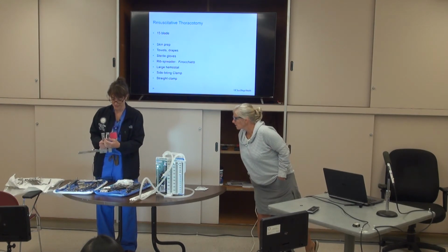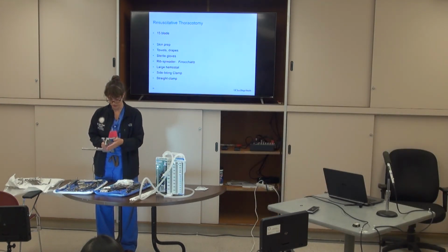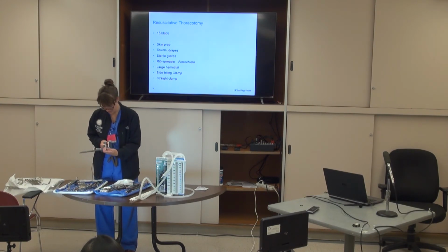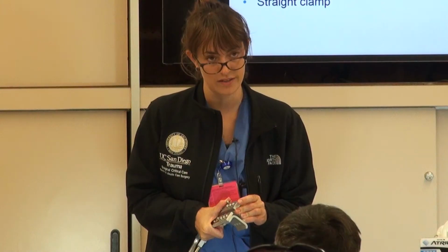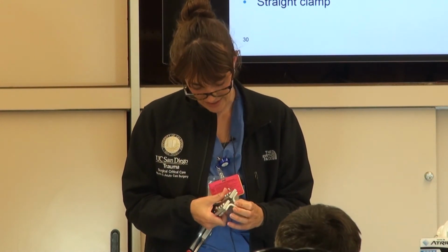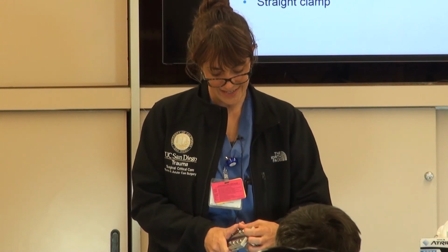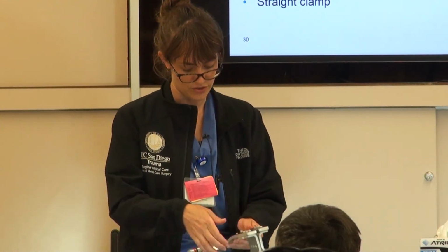Right, so this one's partially assembled. This is correct, see this? So these splay out, and there should be 2 of these. Okay, so we put this in. They slide into place, and then these slide alongside it. I encourage you guys to actually practice, just try this. It's not that you need a lot of practice, but just to try it. And this one actually won't even slide down. So this one's not working well either. However, my guess is that it would actually be adequate for us to do the resuscitation.